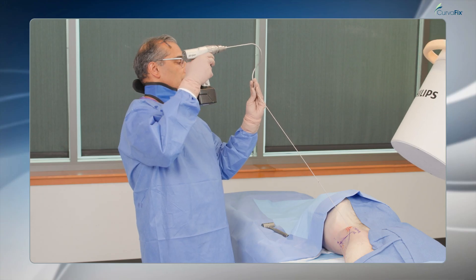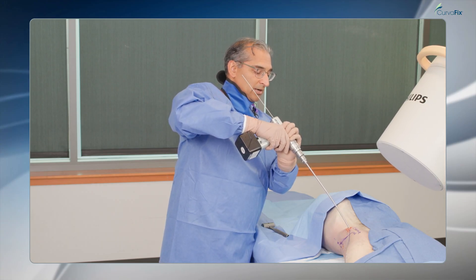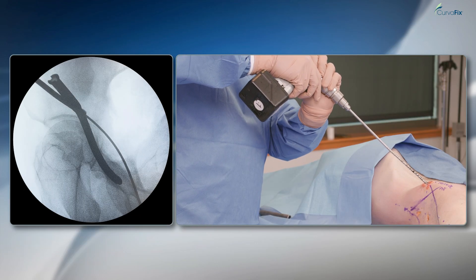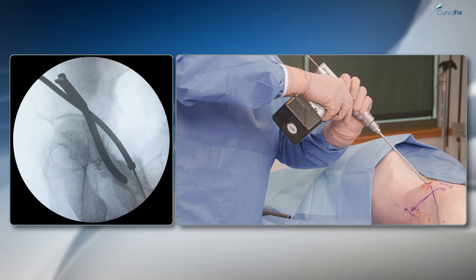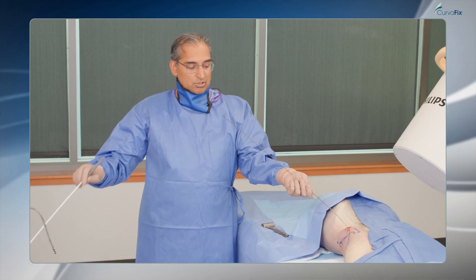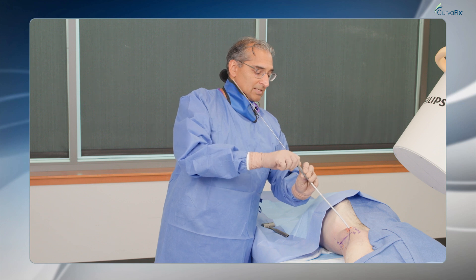The flexible reamers are really important here because this is a very convoluted corridor to go down. You can hear bone the whole way — it gets really tight. The reamer is getting past the existing screw and then rocking around the acetabulum before getting hard again. I'll come back out and take the exchange tube. This is a very narrow, tight corridor, and sometimes you do have to turn the beveled guide to navigate your way down. Now my guide wire is down.